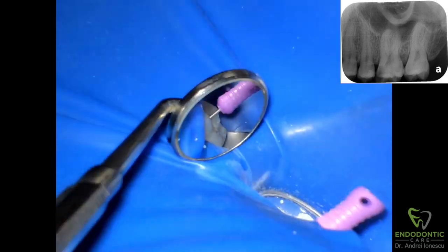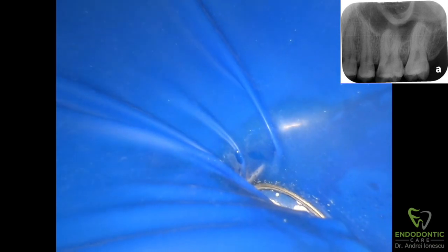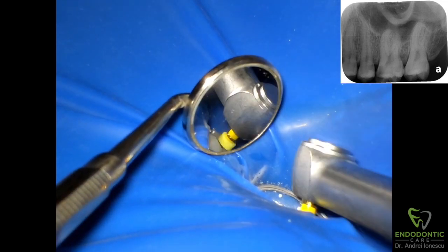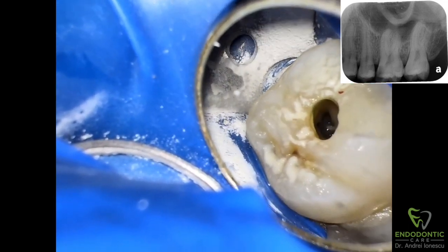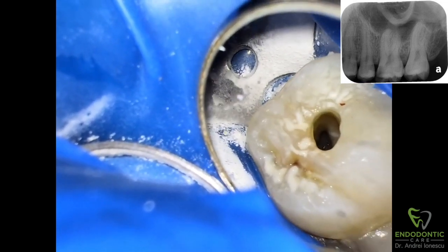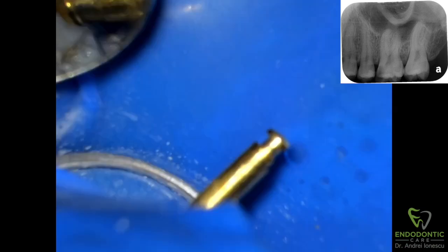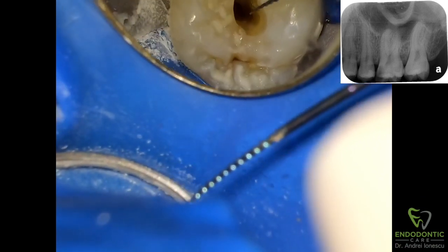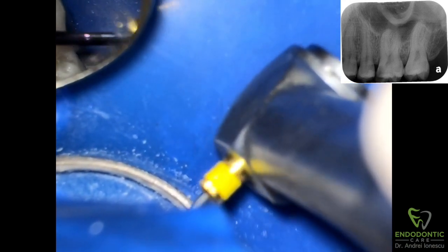Size 6, 8, 10 files, then I used the path files from Tulsa. Alright, there we go, glide path is complete. Confirming the working lengths now, and now we start to instrument — so right off the bat I start with a 20.04.